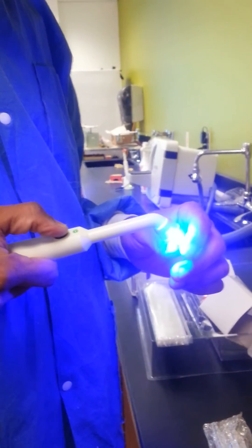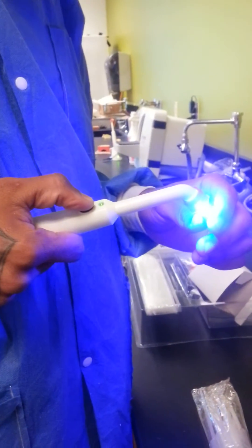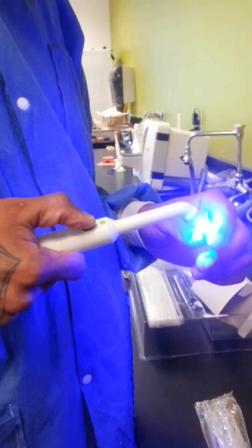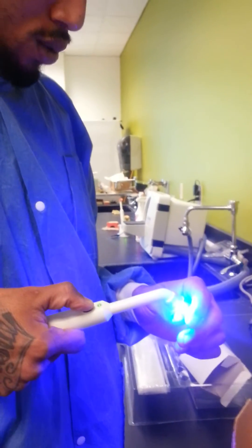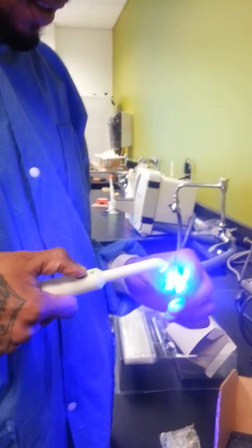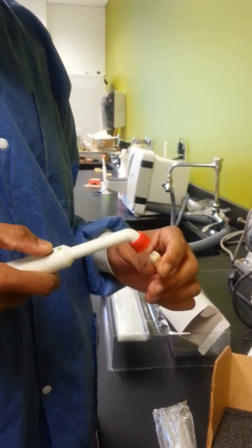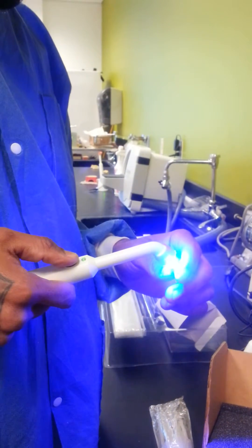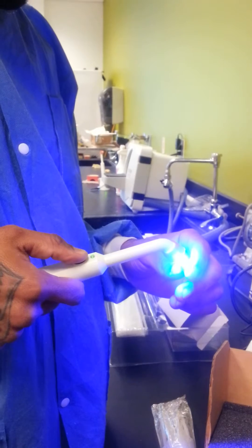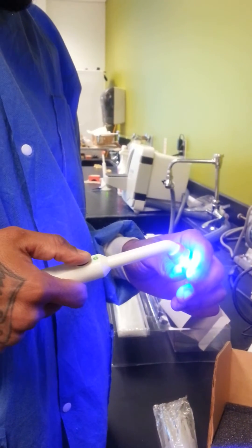Using the curing light for 30 seconds. 1-1000, 2-1000, 3-1000, 4-1000, 5-1000, 6-1000, 7-1000, 8-1000, 10, 11, 12, 13, 14, 15, 16, 17, 18, 19, 20. Ten more seconds: 1, 2, 3, 4, 5, 6, 7, 8, 9, 10.